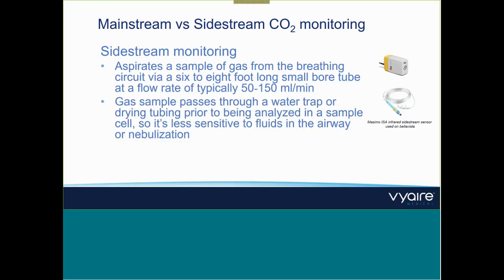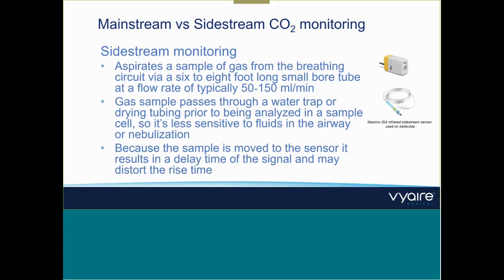And on the good side, when you have fluids on the mainstream, you will always have alarms, because the fluid, as I already explained, is affecting the measurement. This doesn't happen too much on the Sidestream, so this is an advantage of the Sidestream, that it's not so sensitive against fluids. And as I already said, there is a delay time because of the 2 meters sample line, which has some seconds to get through the infrared monitoring unit, and so we always have a little bit of a delay. So it's not that exact like in mainstream capnography.